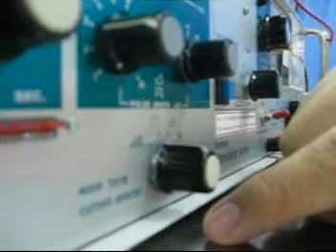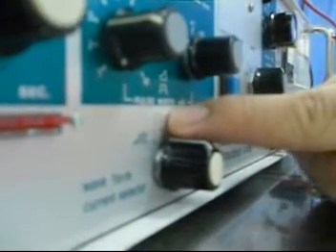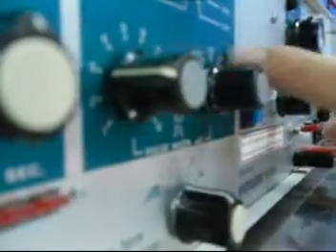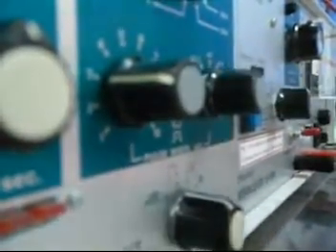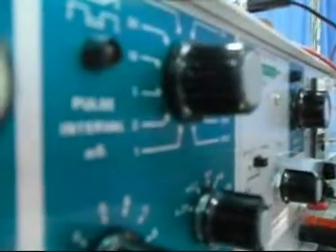If you select the bipolar technique for denervated muscle, you can set the parameters. First, select the waveform. Adjust to rectangular waveform and pulse width greater than or equal to 10. I select 3 and 10. Pulse interval 500 to 1000.